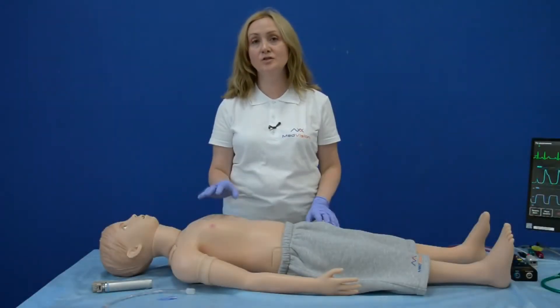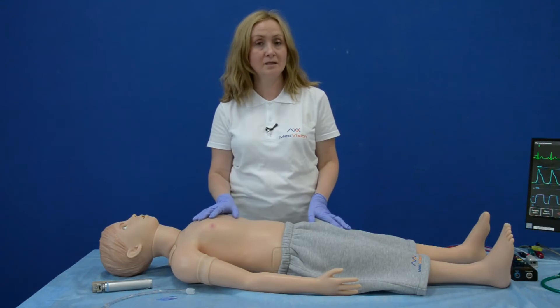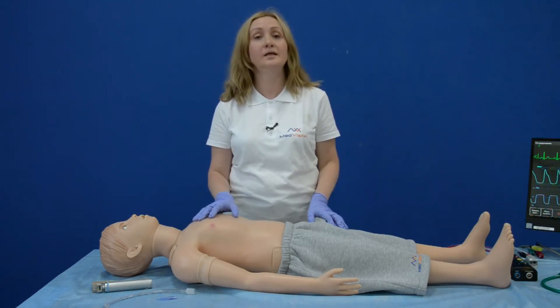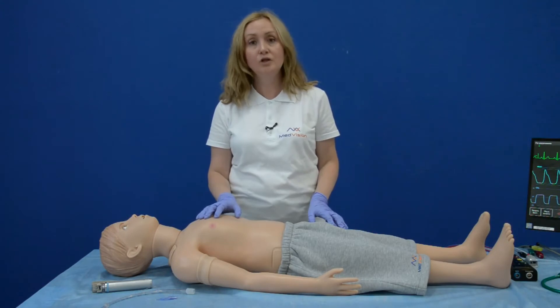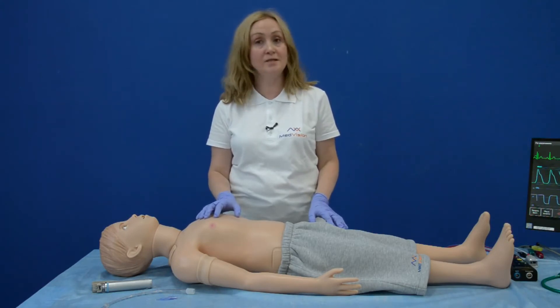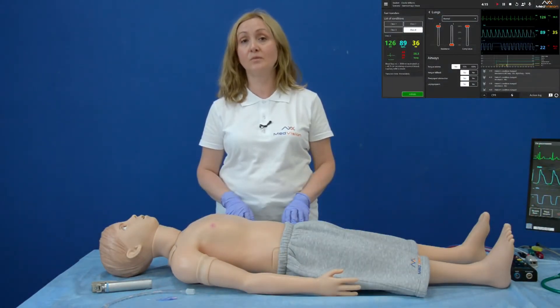I would like to pay attention to the skin of the simulator. It is whole, seamless, durable, elastic, and true to life in its appearance and feel. Due to the quality of the skin, you can perform manipulations as many times as you want because no signs are left.